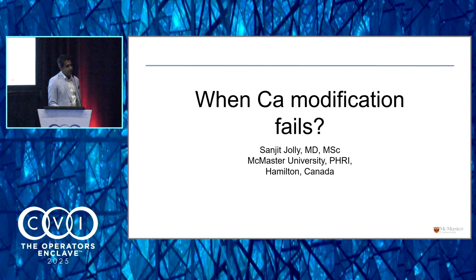So what I would say is that in concentric calcium, as long as you undersize, it's quite safe, and I think Allison will attest to this. I think where you can run into problems is when you've got eccentric calcium and it only expands in one direction and you oversize that balloon without imaging, that's when you run into problems.